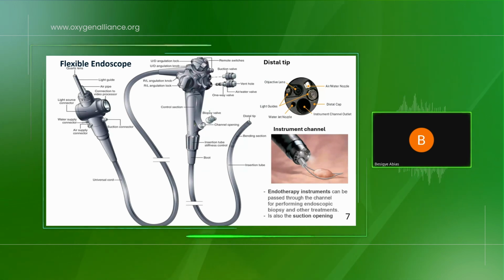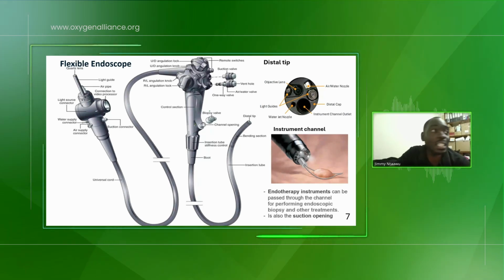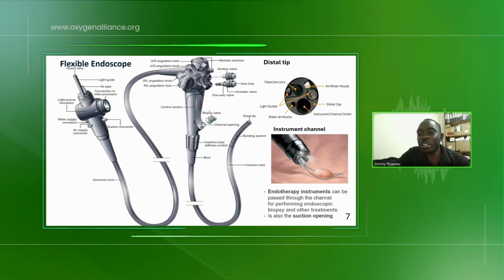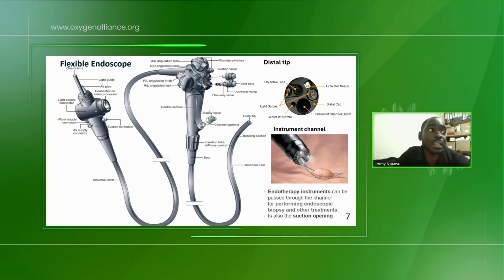Did you confirm the pigtail by testing it with another scope? If that is it, then you need to replace it. Just contact me and forward to me the details of the model of the processor you have. I'll connect you to the person who supplied you the pigtail.